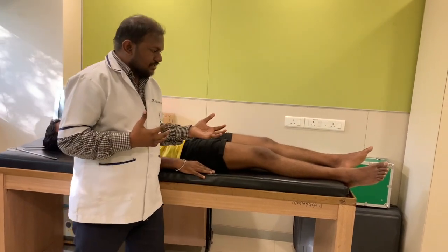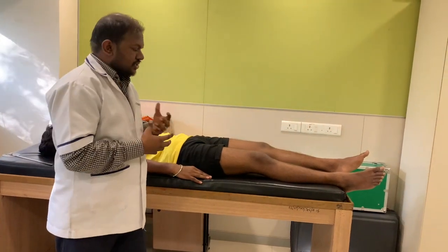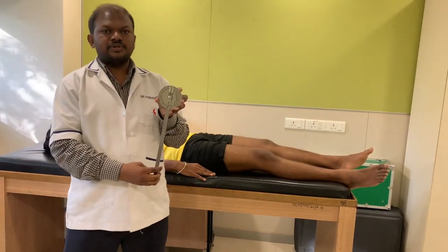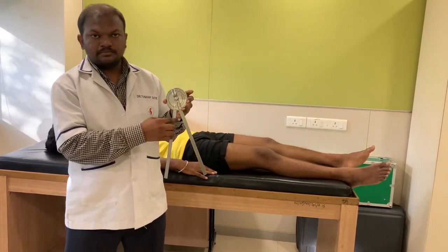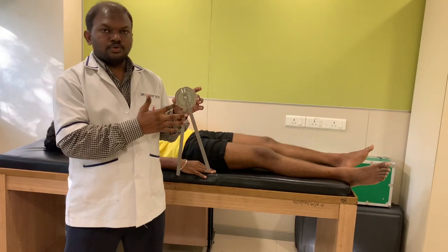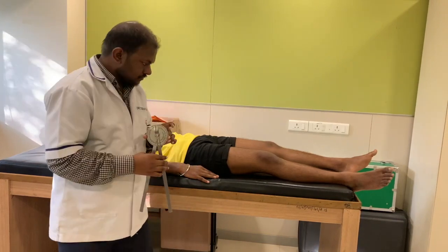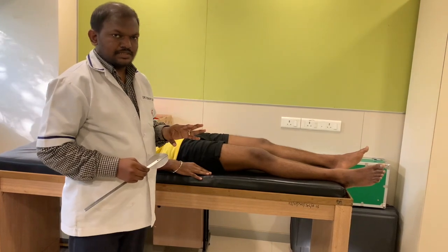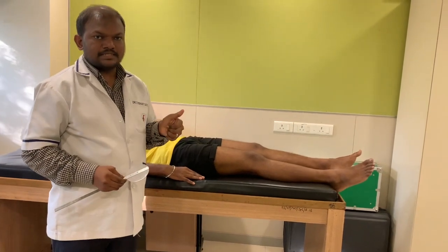Okay. Now, once we know what the axis and the movements are, we will see how to place a goniometer to check the knee range of motion. So this is a universal type of goniometer in which we have a stabilizing arm, a movable arm, and a goniometer body. Here this center point is known as the fulcrum. To keep a goniometer, we need three major references, that is where to keep the fulcrum, where to keep the stabilizing arm, and where to keep the mobilizing arm.